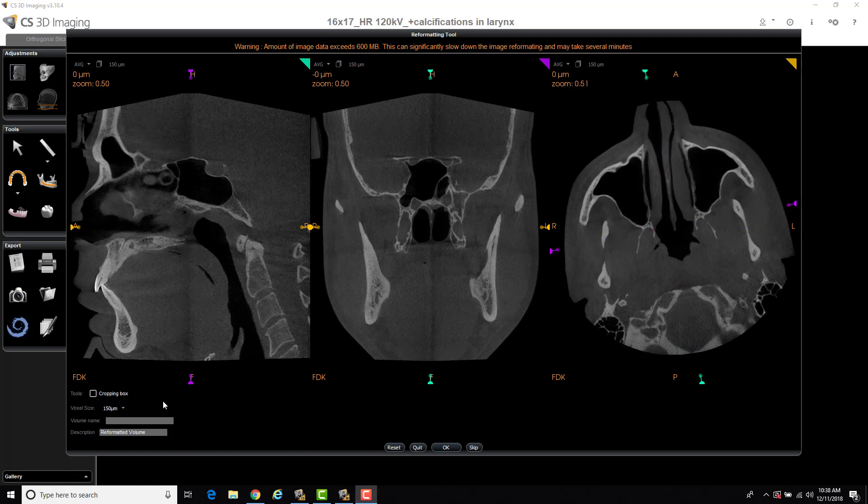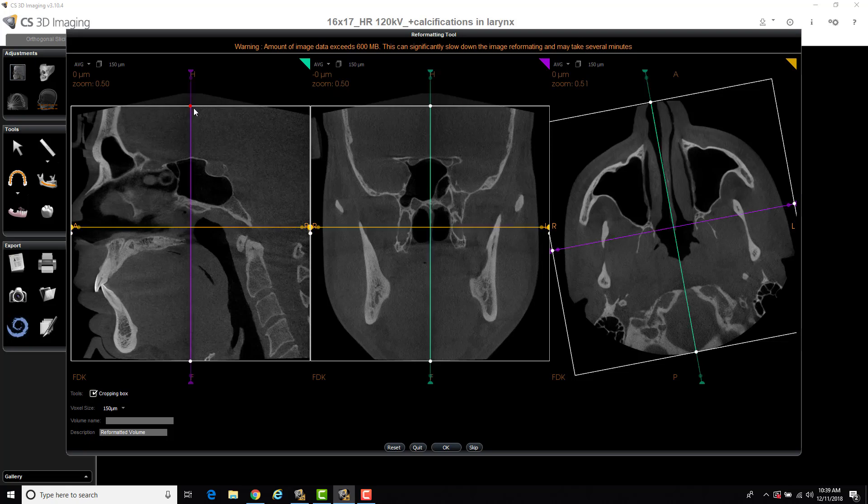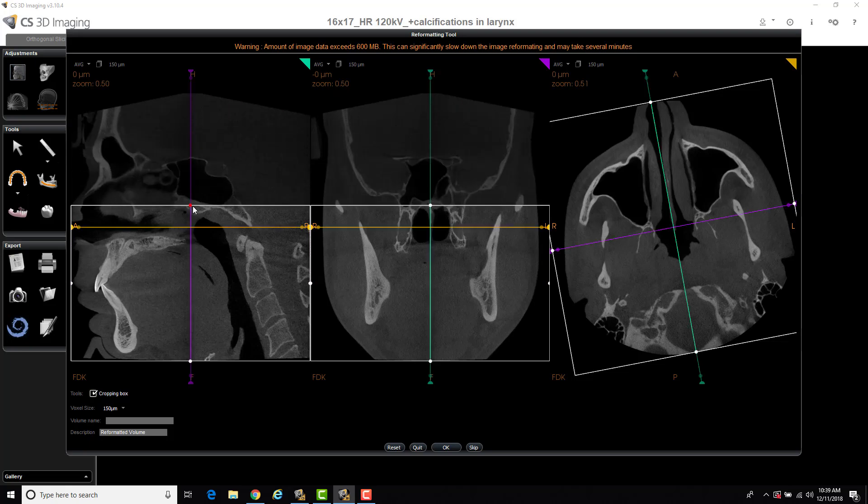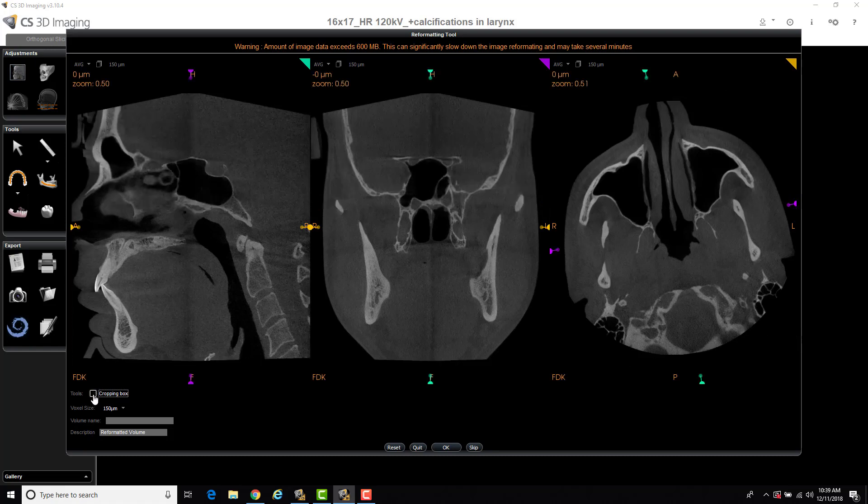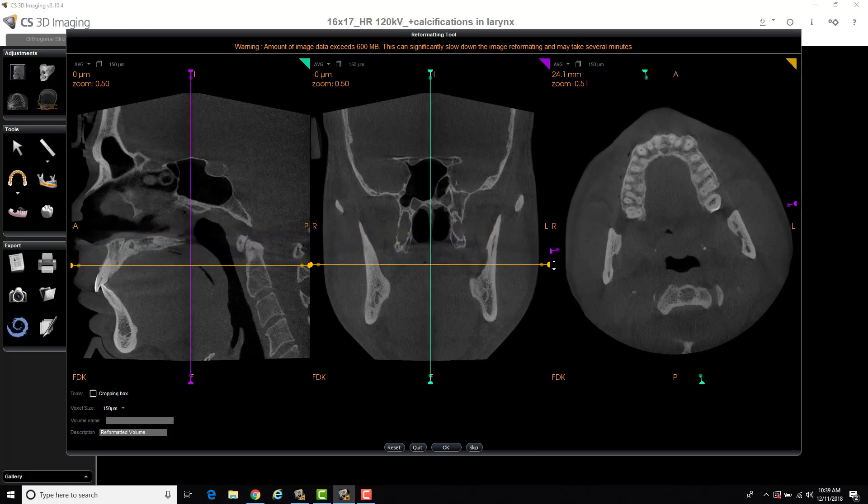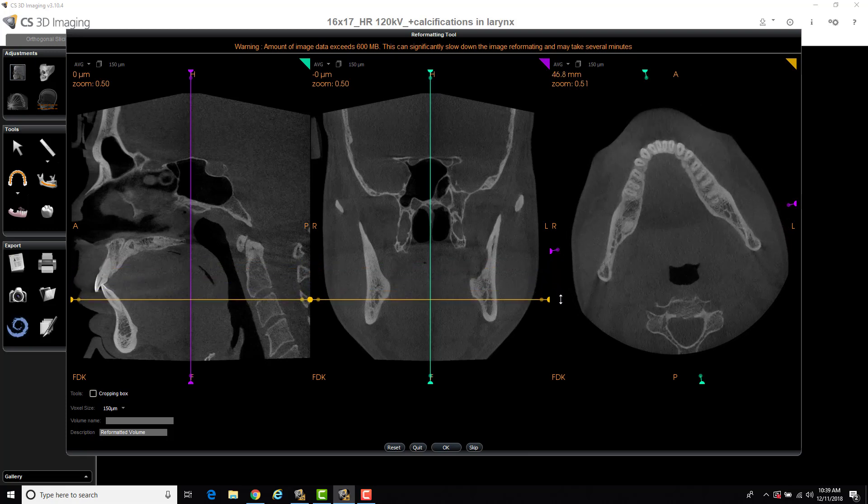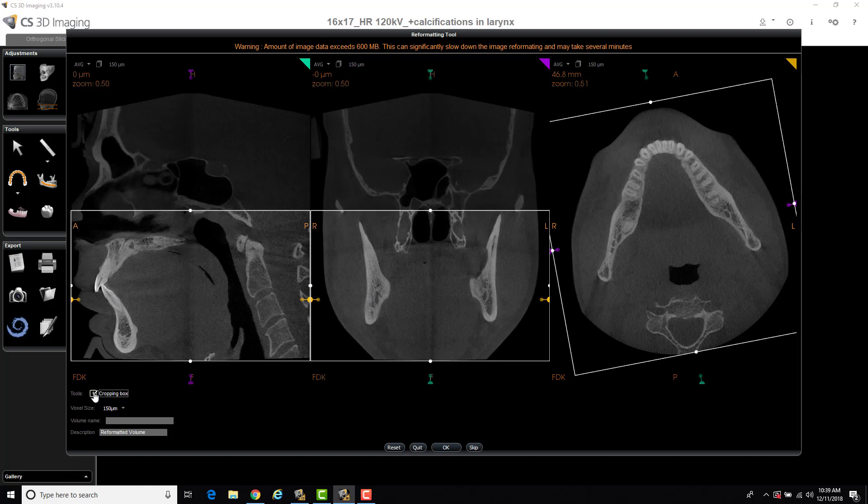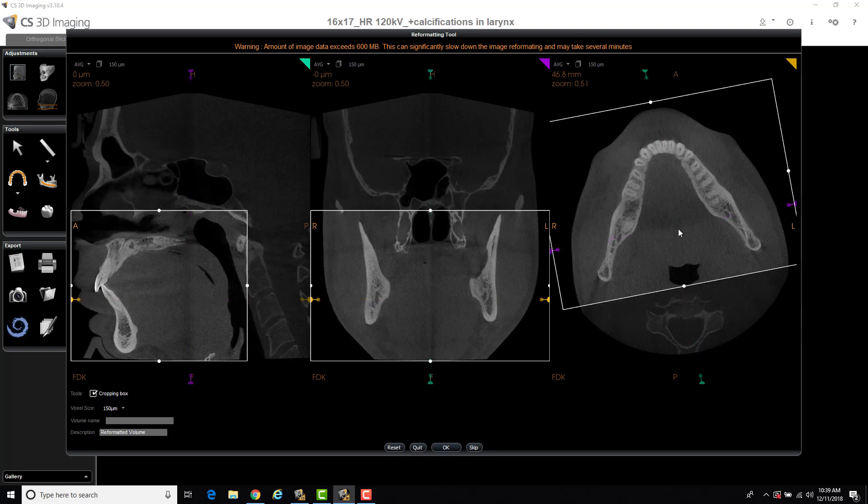Next thing you can do is select the cropping box, and that will pull up the cropping boxes where each of these boxes, I can put my mouse over the little movement handle here, and I can now crop down this area of interest to exactly what I want. If I deselect my cropping box, I can also move my axial view a little bit better, so I can actually see, for example, the mandibular arch. Go back to my cropping box, and now I can visualize my arch better and crop out unnecessary information.